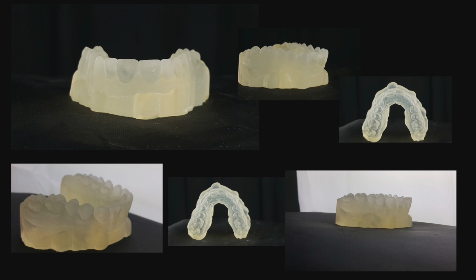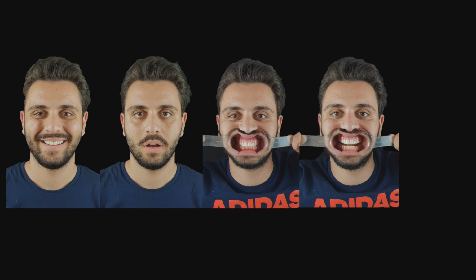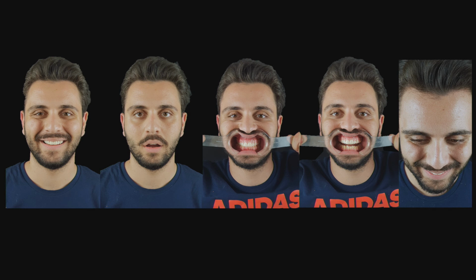After printing the STL file, this is the printed model. We take an impression on this printed model, and we put bis-acrylic, and you can see the result in the mouth of the patient. We can do all the steps again, and you see the new mock-up for the patient and the new design.